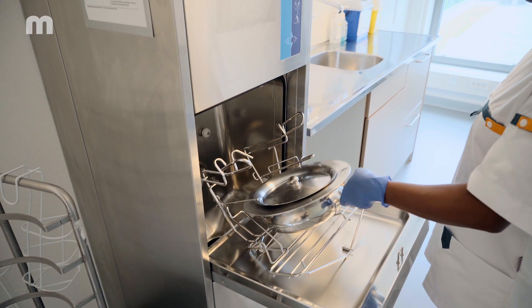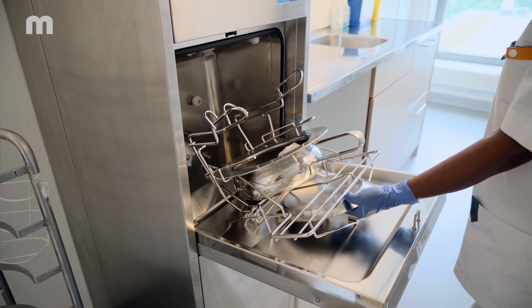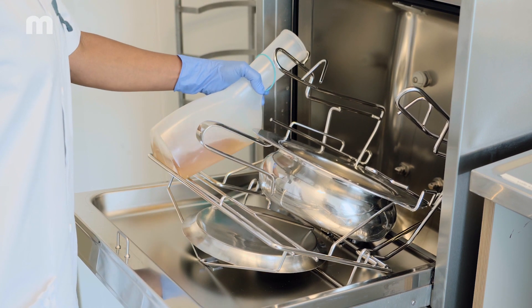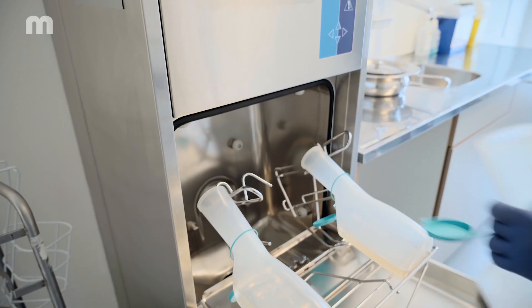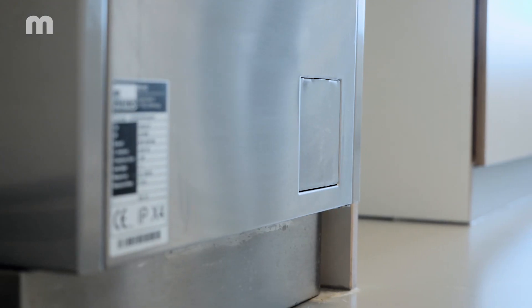Place the care utensil and contents into the bedpan washer disinfector. Take care to avoid contact with the contents and never empty the bedpan and urine bottle manually beforehand. It is very important to place the utensils correctly in the holder inside the bedpan washer disinfector.